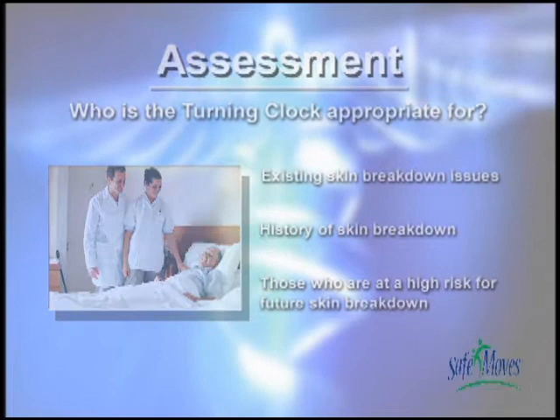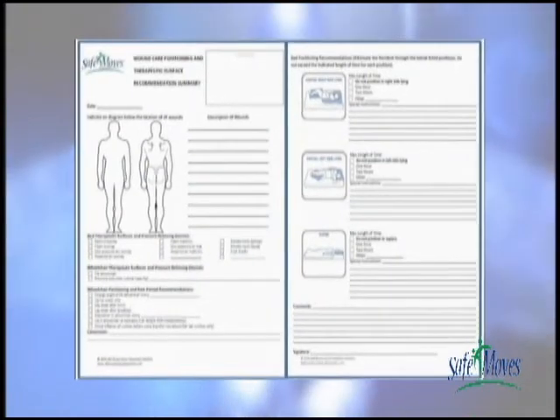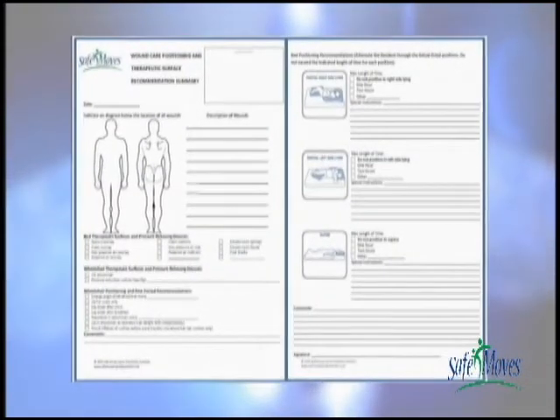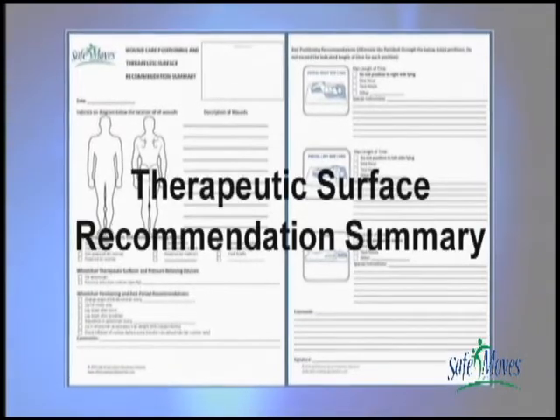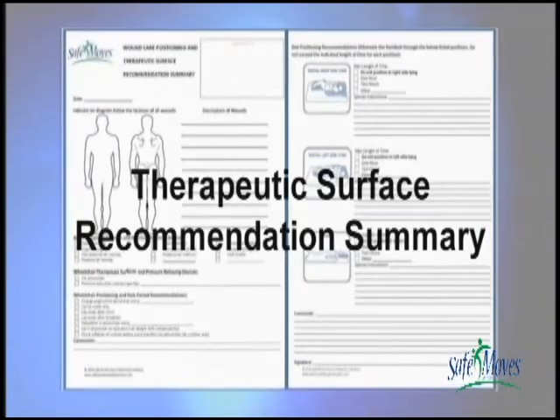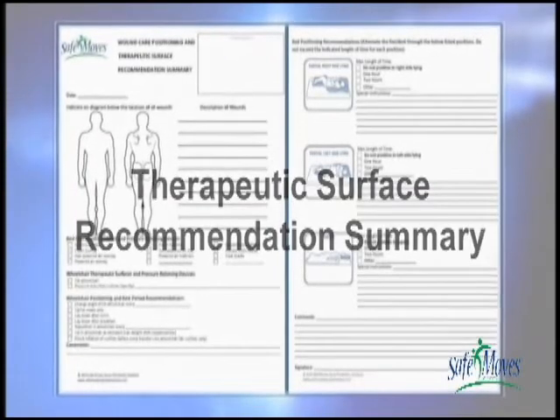Now that you have selected those who could benefit from a reliable repositioning routine, it is necessary for your facility's wound care champion or wound care team to assess these clients using the wound care positioning and therapeutic surface recommendation summary. Let's briefly review this simple tool.